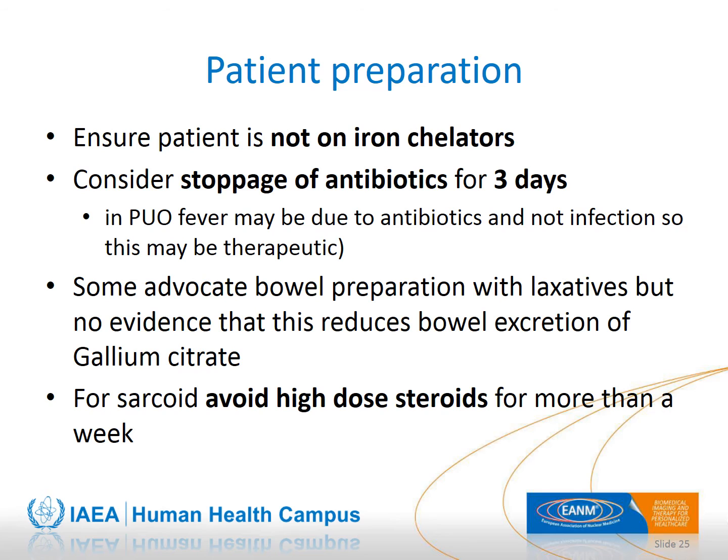To ensure we get the best results from our gallium citrate imaging, we do need to ensure that the patient is not on iron chelators. We also need to consider stoppage of antibiotics, as antibiotics can dampen the inflammatory response. Some centers advocate bowel preparation with laxatives to reduce the bowel uptake and excretion of gallium citrate.